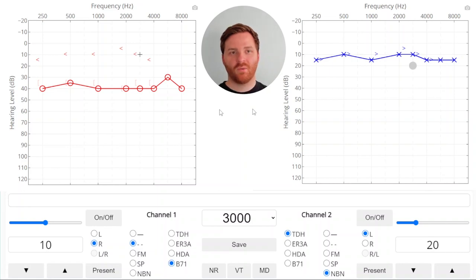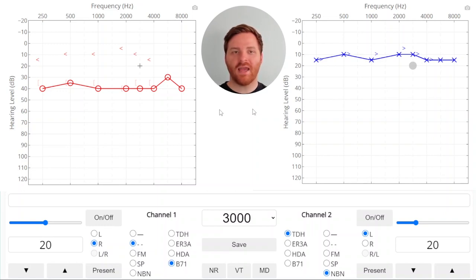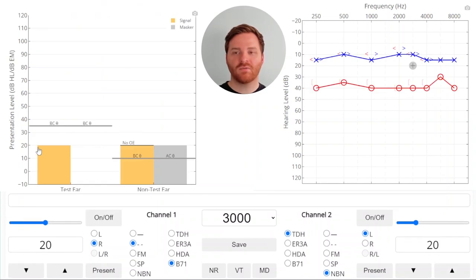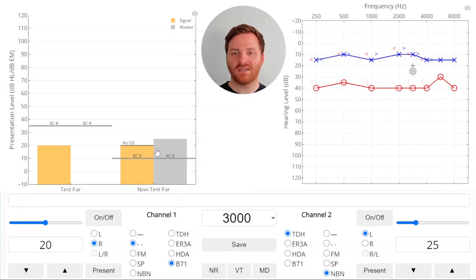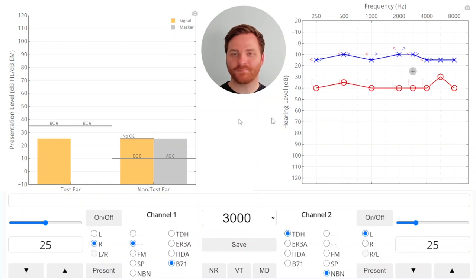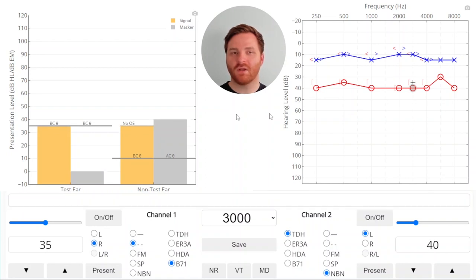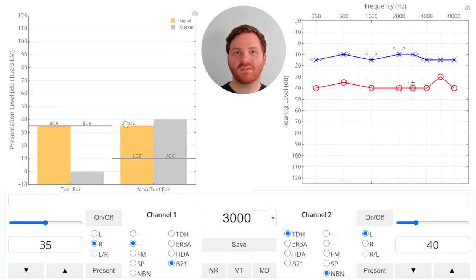Let's do another threshold. At 3000 Hz, we add our 10 dB safety pad for the masker and we present to get no response. So we raise our signal again until we get a response. Why did the patient respond here — is it because they heard it in the test ear or because they heard it in the non-test ear? Let's turn on the masking tool. You can see that they didn't respond because we're at threshold in the test ear — they heard it because it crossed over. So we would raise the masker, but raising the masker only increases it 5 dB to cover up this signal, so it's no wonder that they don't respond. But when we raise the signal, the patient will respond. When they respond, you raise the masker and the stimulus until you reach a point where you get a response even after you raise the masker. If you get a response after you've raised the masker, it's because they're hearing it at the true threshold in the test ear. You can confirm this by continuing to raise the masker and the patient will continue to respond.